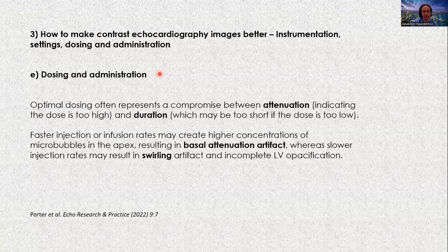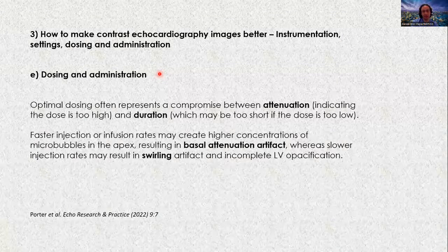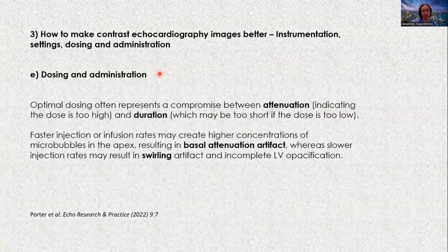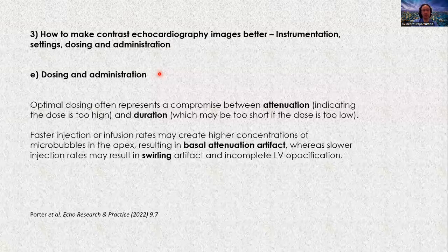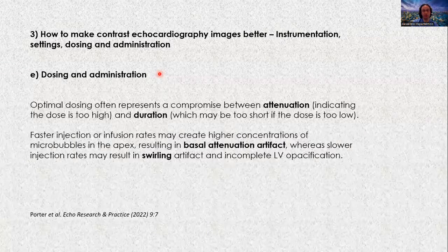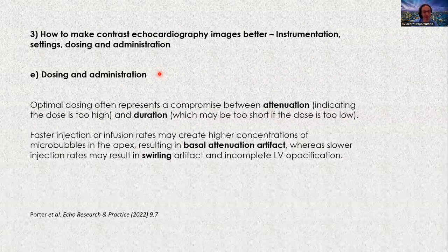And finally, dosing and administration are very important. It is necessary to avoid attenuation of the contrast in the far field. That happens when you have a very high dose, which accumulates at the apex. But the duration of the infusion is also very important, because if it's too short, then you don't have good opacification.